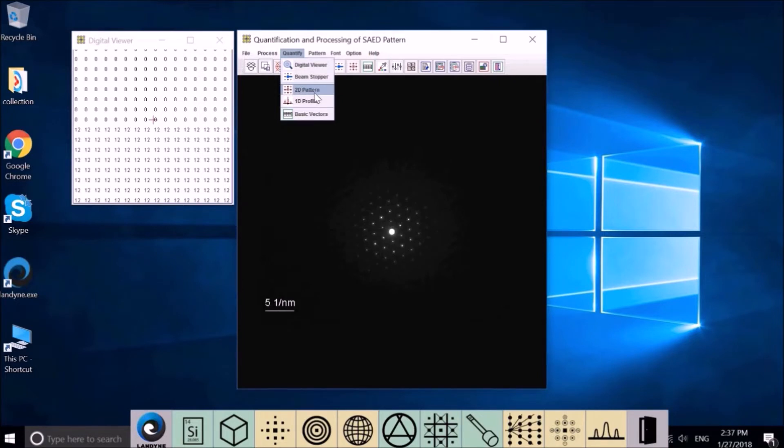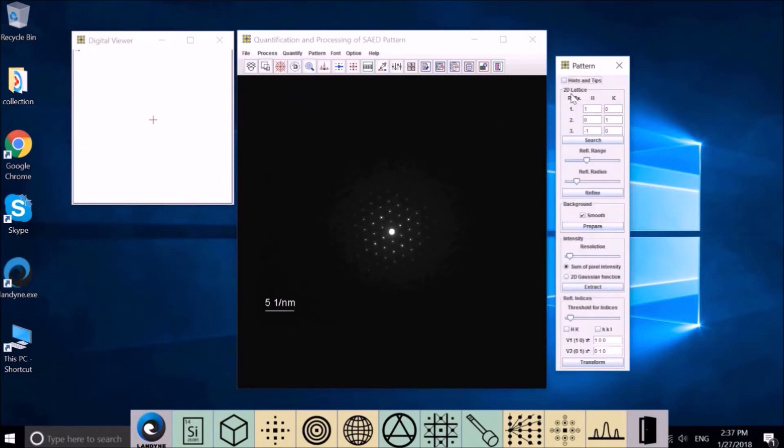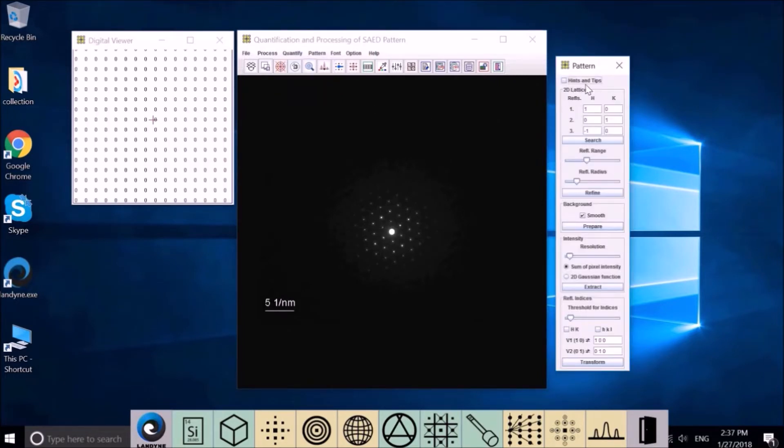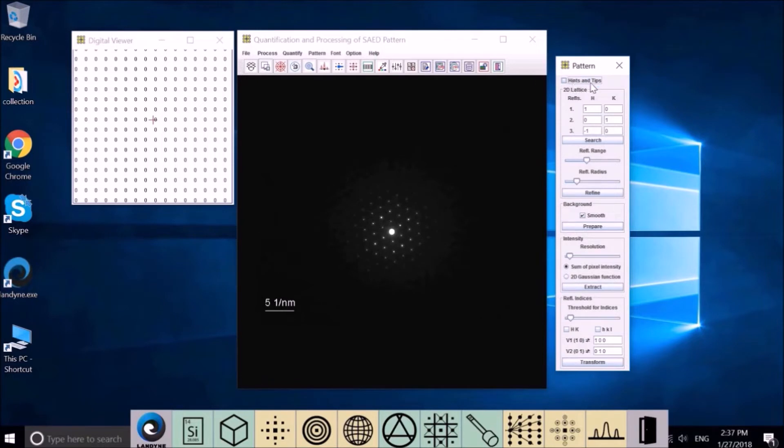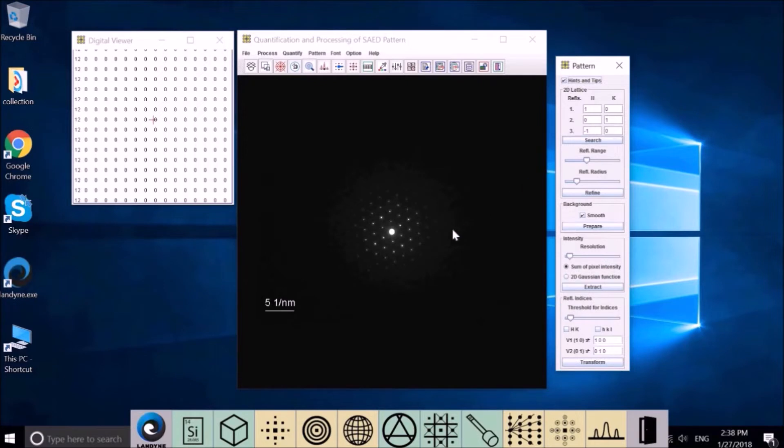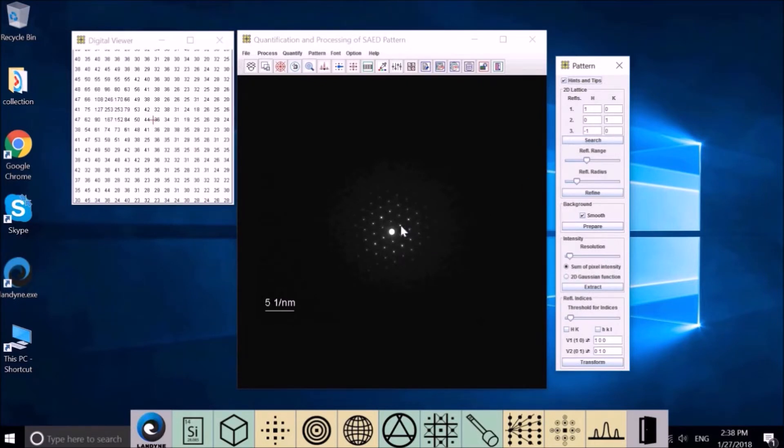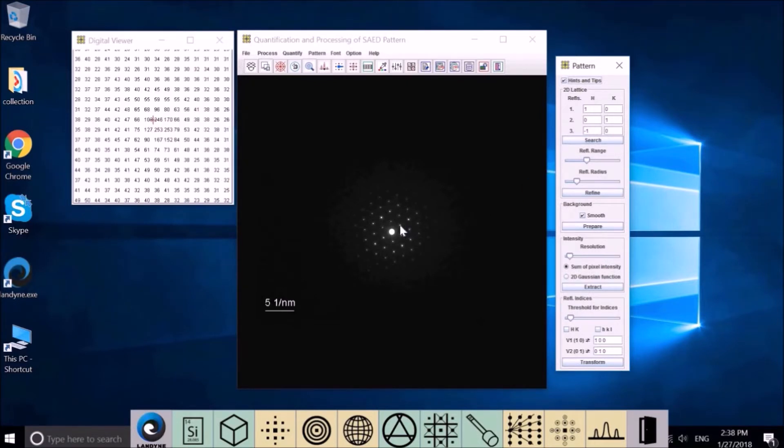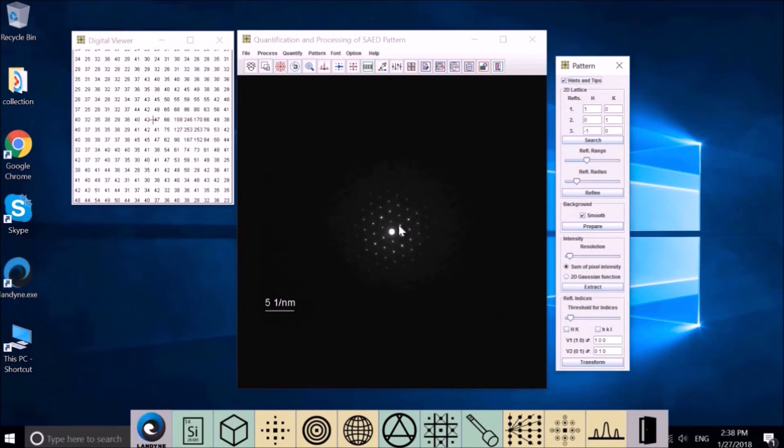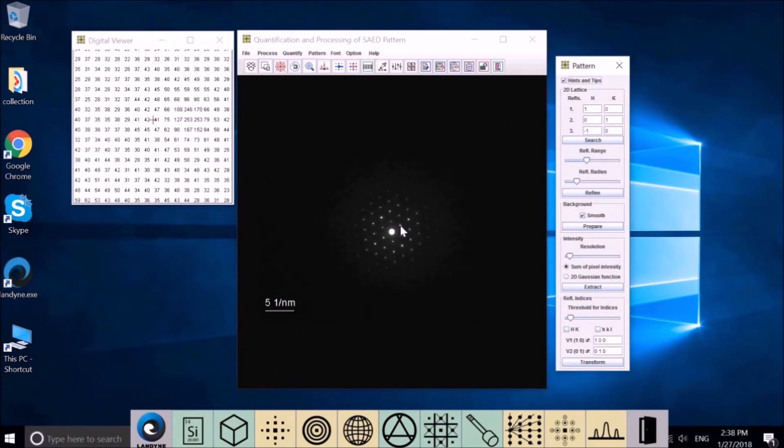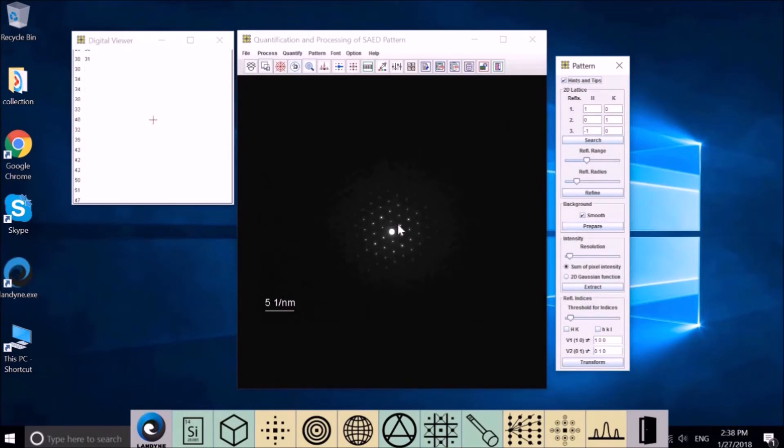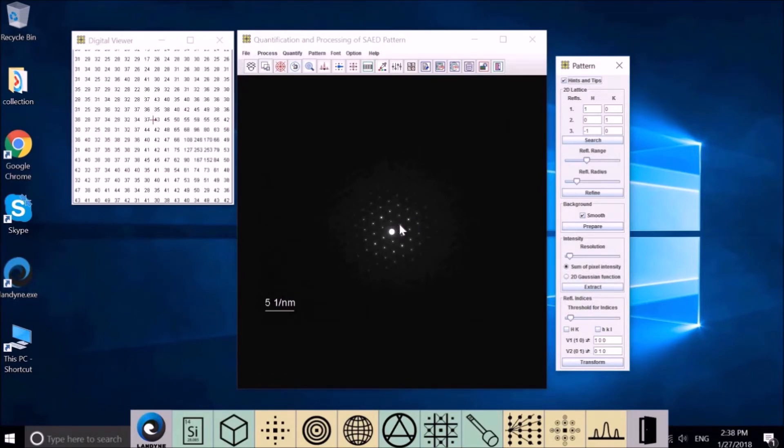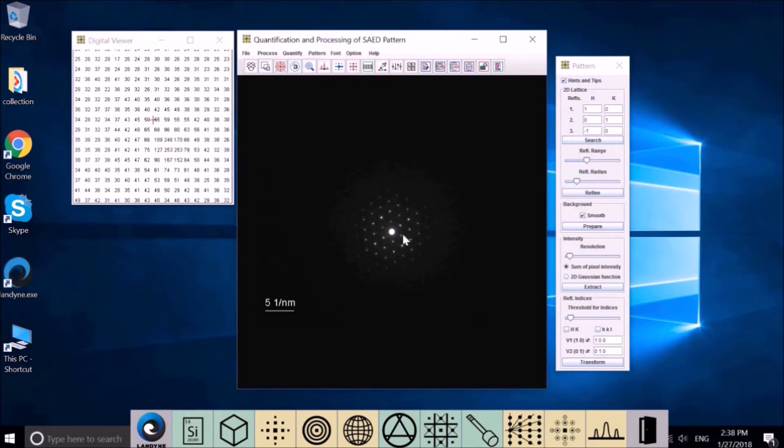Now let's find out the two-dimensional basic diffraction vector. Go to 2D pattern. First, find three spots in two dimensions. Give any index. The default is 1,0; 0,1; and -1,0.